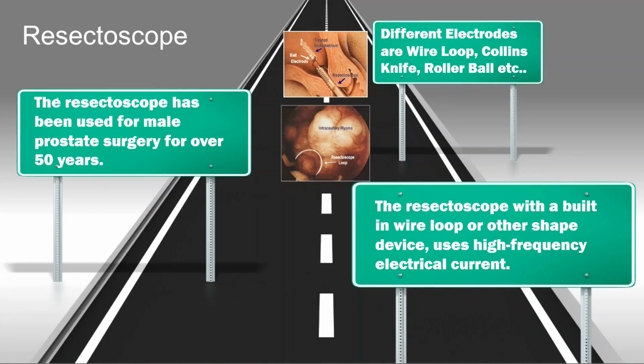And the camera will attach here, the CCD. The CCD should always be held like how we hold it in laparoscopy, and then this has to be rotated. Remember, the entire CCD should never be rotated, and this way you will do resection. So this is the resectoscope, how you perform it. This is the same resectoscope which was used by the urologist. If you don't have one, ask your urologist, he will give you.